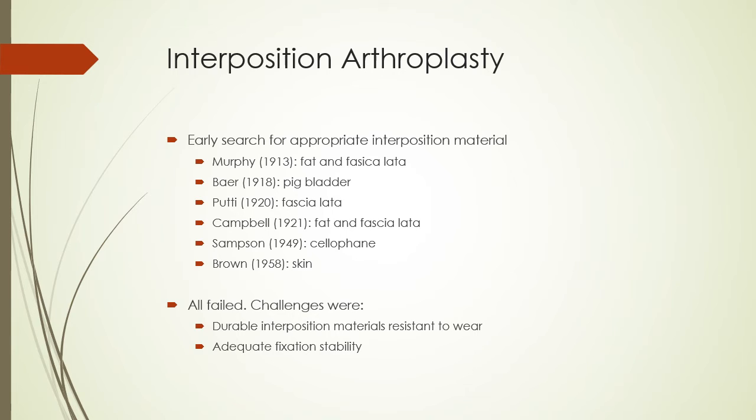The challenges were the same as we observed in the earlier hip interposition arthroplasty. The materials they found were not durable enough to resist wear, and also were not rigid enough, or basically the fixation was not strong enough to remain stable.